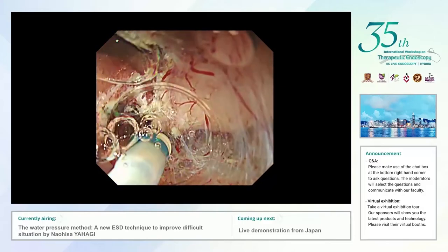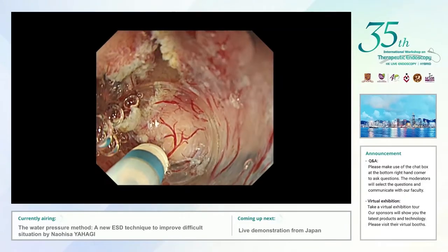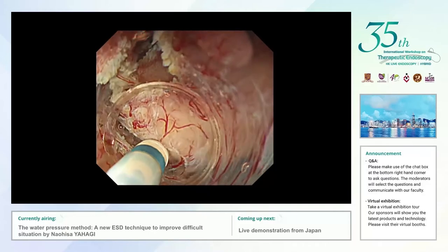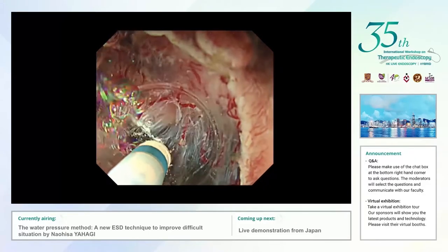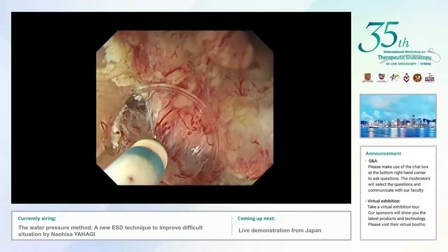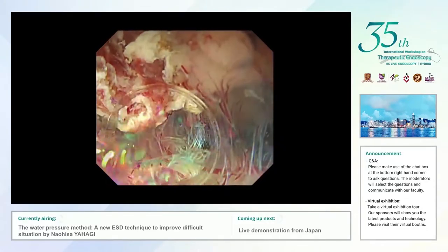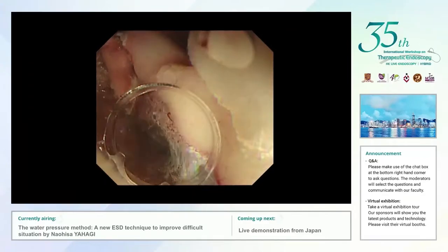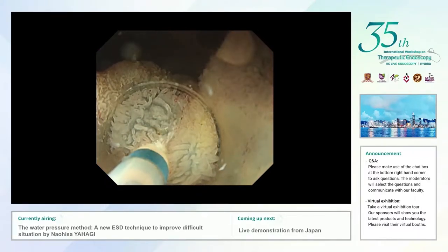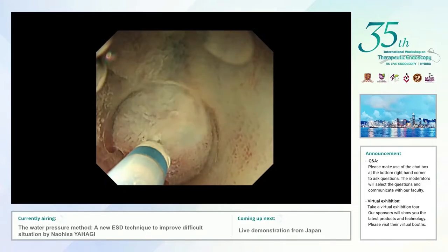This is the beauty of the water pressure method — we can see the beautiful submucosal layer opened by the water pressure. In cases of difficulty conducting submucosal dissection, the water pressure method is still very effective because we can check the remaining submucosal tissue by giving active pressure of normal saline, then coagulate the remaining submucosal tissue and conduct dissection safely. Using the water pressure method, the remaining submucosal dissection went very smoothly. I then moved to the right side, injected the submucosal fluid cushion through the knife, and conducted the mucosal incision going to the left side.